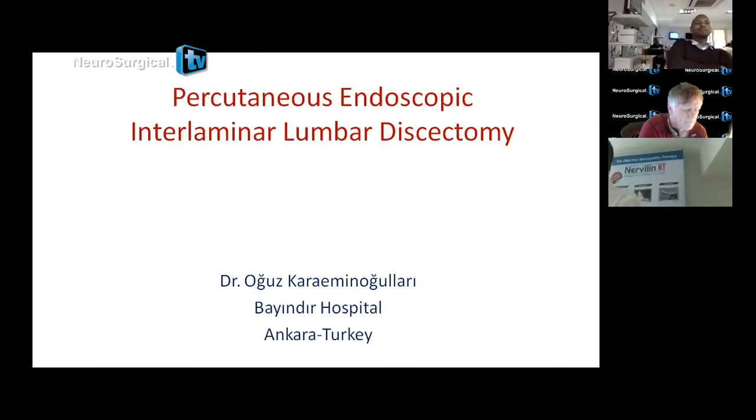And my answer is, they are hard to do also with microdiscectomy, with the interlaminar technique. These discs are hard, not because transforaminal is ineffective. You have to take a lot of bone. And sometimes you finish the operation, you say, okay, I am satisfied, and the fragment is still there, a missed fragment.